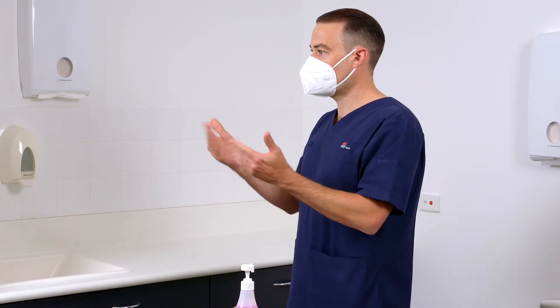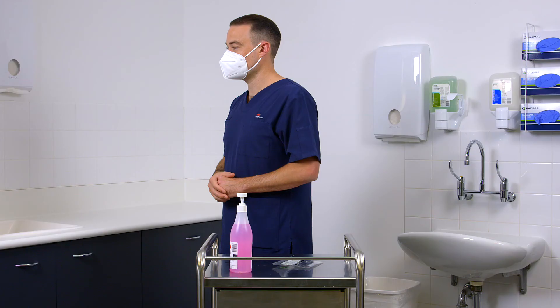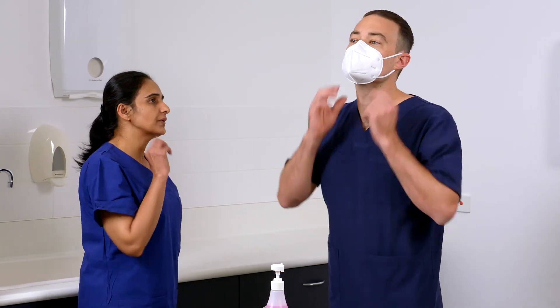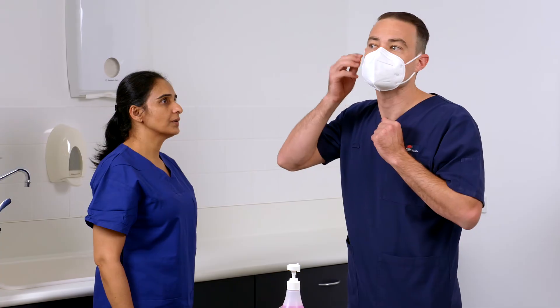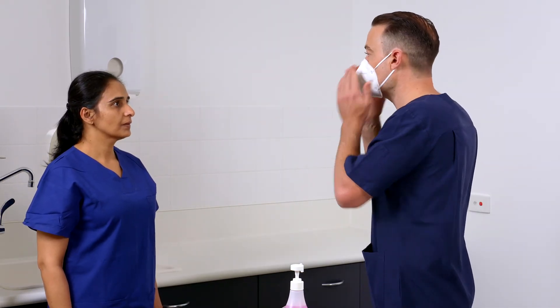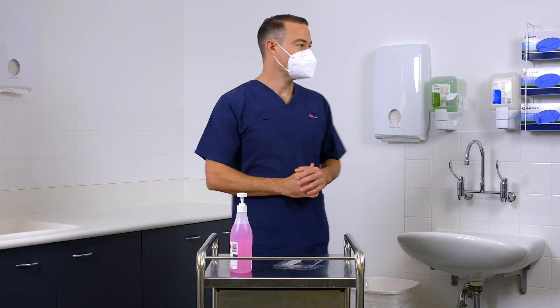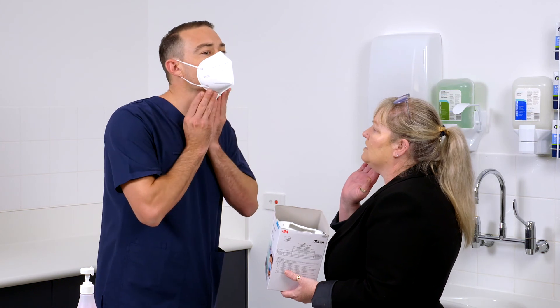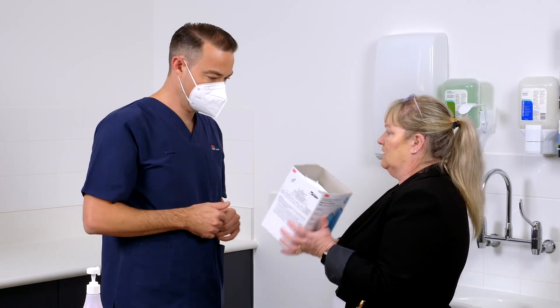If you can't achieve a seal, ask a colleague if available to check that the straps are not twisted or for hair or earrings that might be caught in the seal. After making adjustments, repeat the fit check. If you cannot achieve a proper seal, do not proceed with your clinical activity. See your supervisor for advice. You may need to try a different respirator.